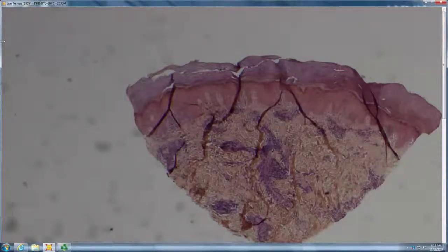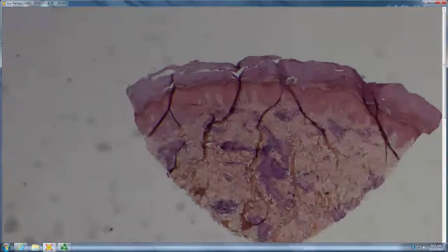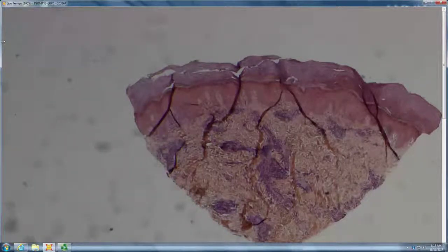Okay, so it looks like there's a lot of inflammation. Post-capillary venule? No, deeper than that. I keep getting them wrong. So what is this? Part of like LCV, part of the Big Five? How big is the vessel? Pretty big, real big. And what kind of vessel is it? It looks like an artery. So what would be a big arteritis in skin? Temporal arteritis, although a biopsy of TA never looks like this, right?